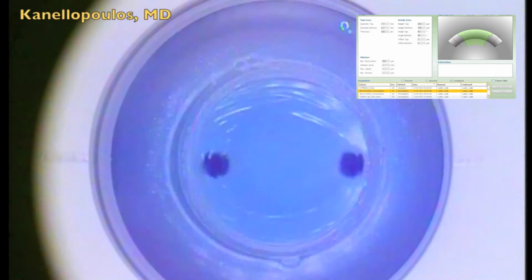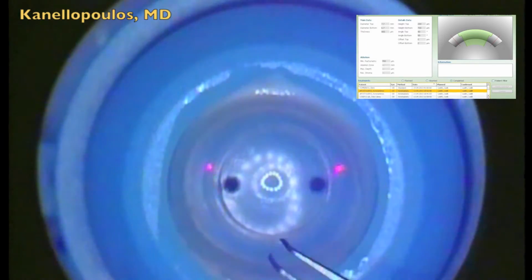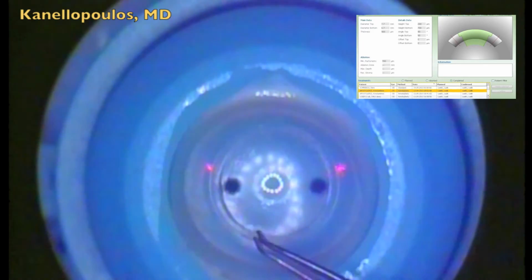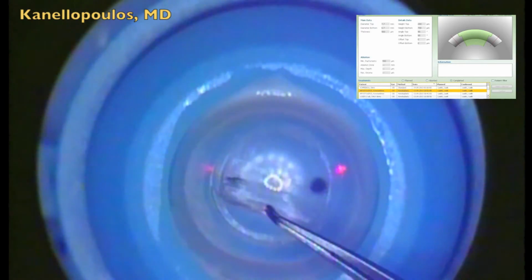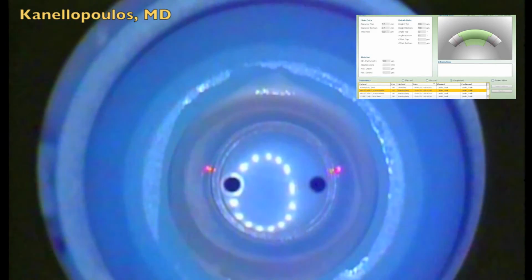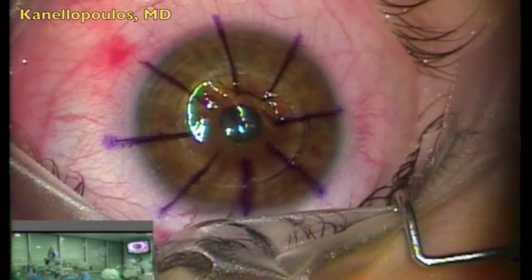We're going all the way through on the trephination of the donor, and soon the trephination is completed. It's remarkable that the trephinations both on the host and the donor are reproduced real time in this video, and it's admirable that by picking with a 0.12 forceps we just have a very clean mushroom-assisted trephination.